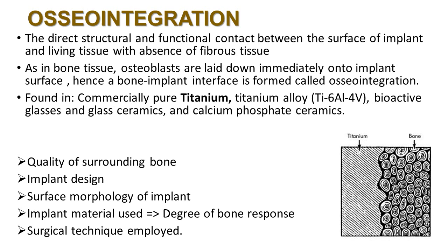So basically this contributes to another quality of titanium. As I mentioned in the earlier lectures, titanium is a very upcoming and popular material because it is highly biocompatible. Another feature is the fact that it can osseointegrate with the bone. And this is, in fact, the only metal that can actually osseointegrate with the bone.